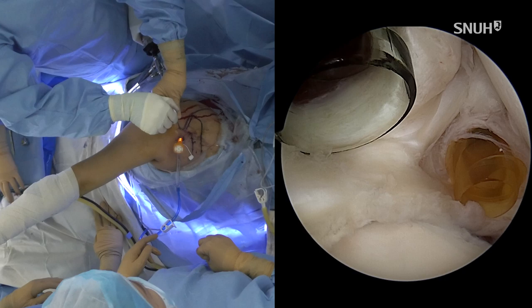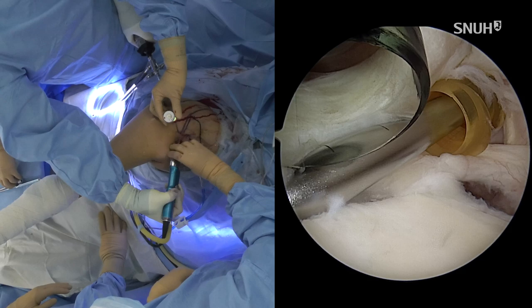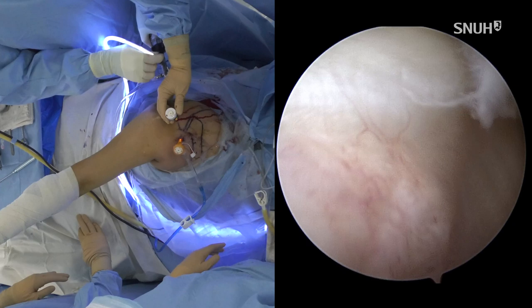And for the fixation of the superior labrum, I prefer to use knotless suture anchors, not only for SLAP, but also for the Bankart repair and capsule applications. I like to use the knotless suture anchor. You can put the suture knot outside of the glenohumeral joint, like over there for the SLAP and the Bankart repair.